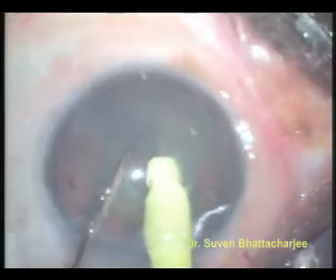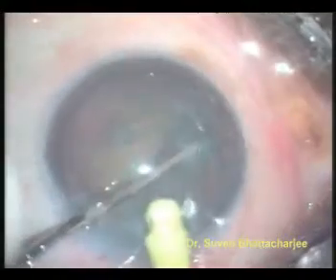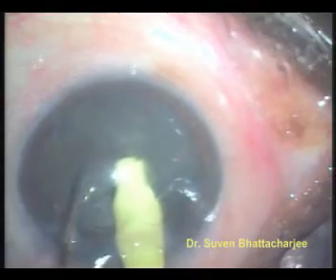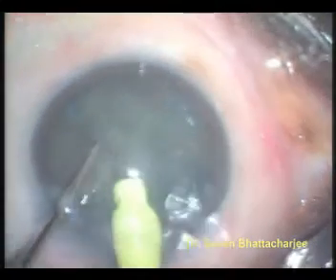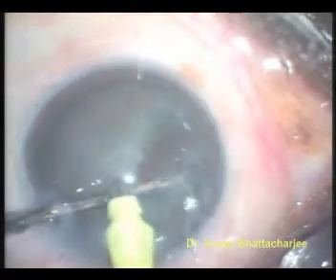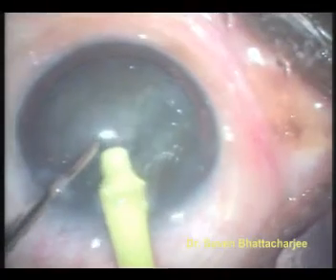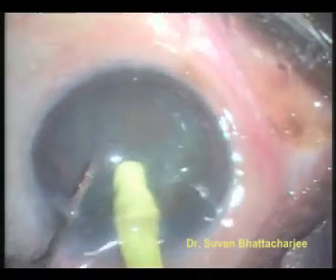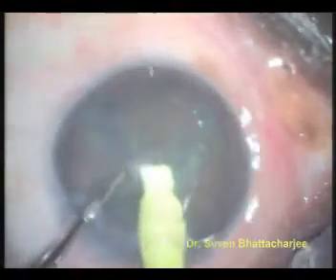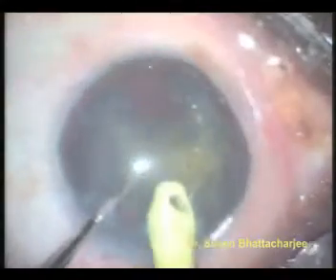Now we have two halves of the nucleus. These halves are further broken down into quadrants by further chopping. The moderately hard cataract is ideally suited for this process of chopping, which minimizes the amount of phaco energy used. Once the four quadrants are made, each one is further broken down by ultrasonic energy and sucked out using vacuum.